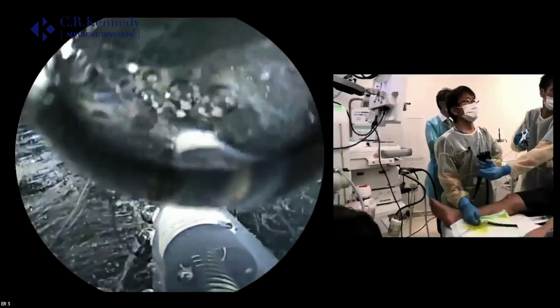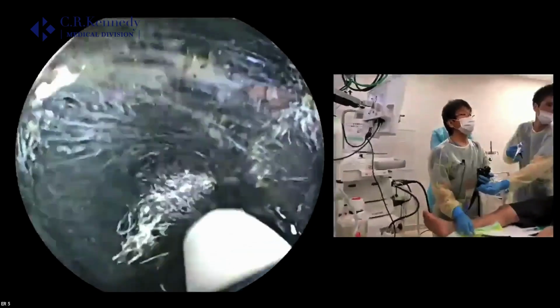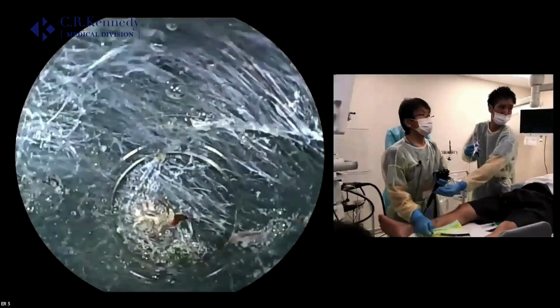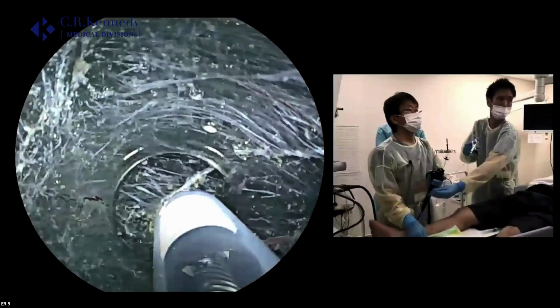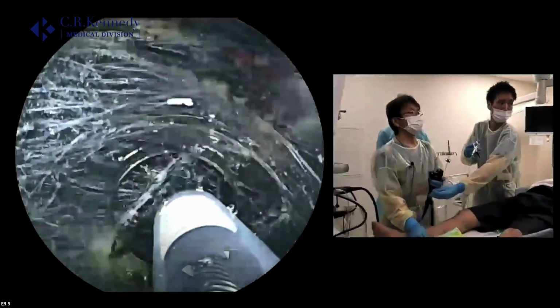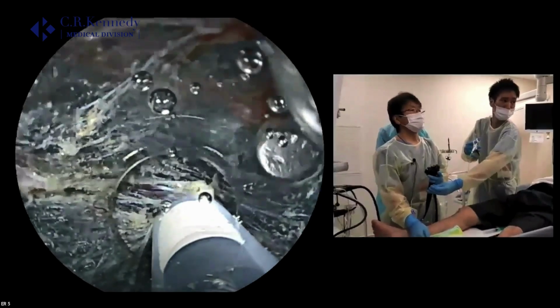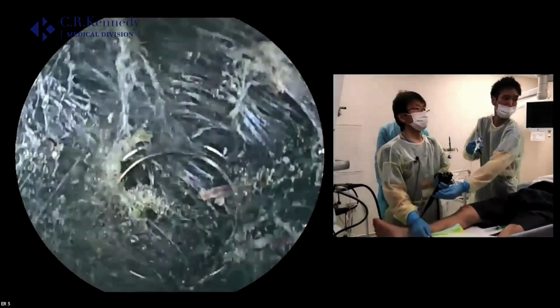So just one way. So it is easy to keep a good, clear endoscopic view, and a little bit of bleeding or a bubble created by the electricity goes away. Doesn't interfere with the endoscopic view.